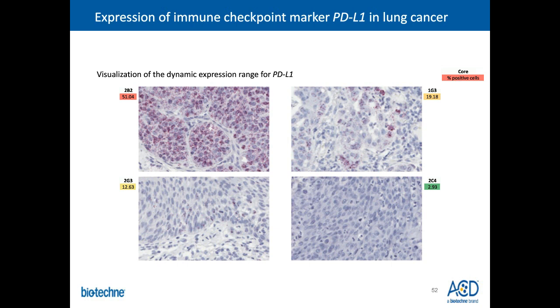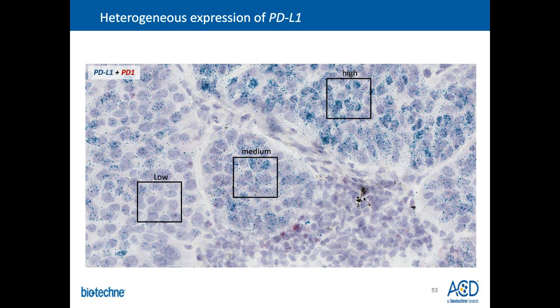In addition to the inter-tumor heterogeneity, we can also visualize the intra-tumor heterogeneity. As you can see in this image, PDL1 especially is extremely heterogeneous. In the same tumor, the degree of expression of this marker varies dramatically based on the region that you're visualizing. And this can be extremely significant if you're trying to develop immunotherapies against specific targets, in this case, PDL1. So this technique allows you detection at a single cell and single molecule level and allows you to understand the heterogeneous expression of specific markers.